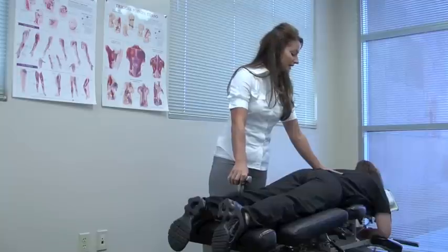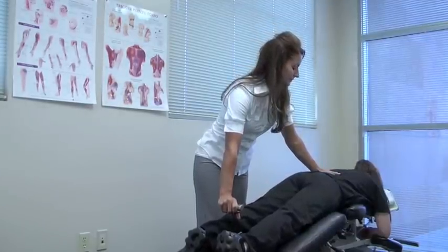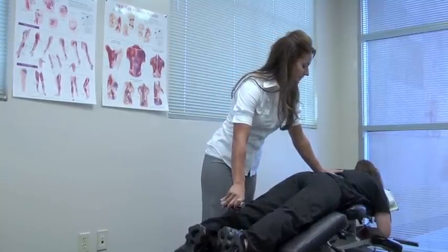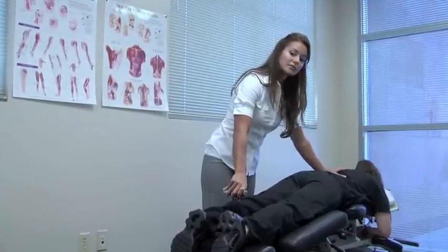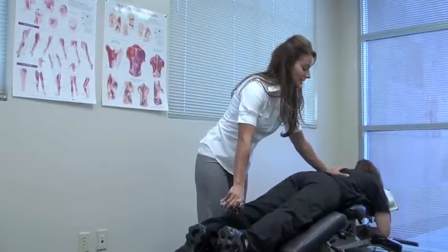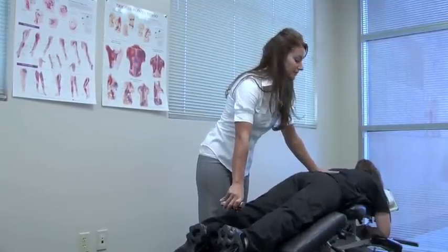Okay, so I'll add my tension. We'll stretch the spine forward and then up. Good. So this is a very comfortable and effective treatment that helps restore proper motion to the spine and also helps assist the soft tissues like the muscles and ligaments surrounding the spine to heal.